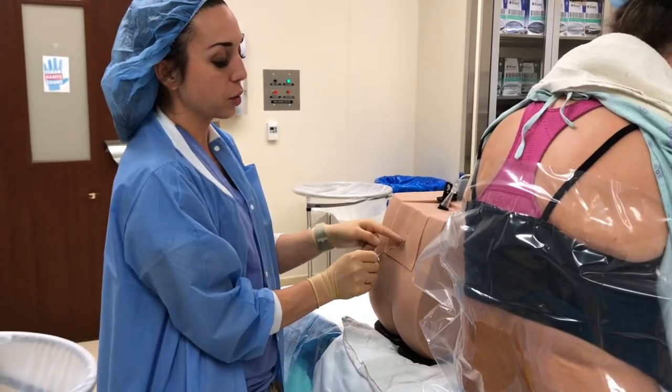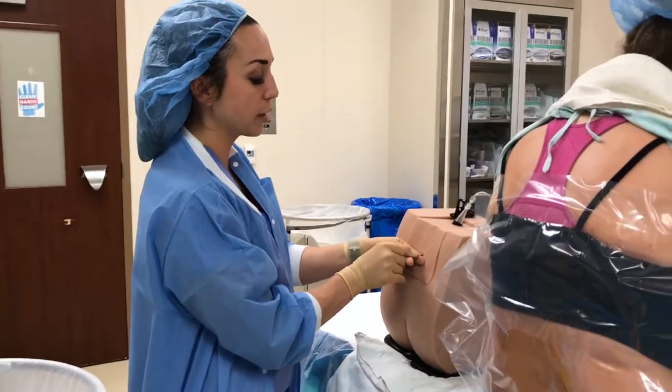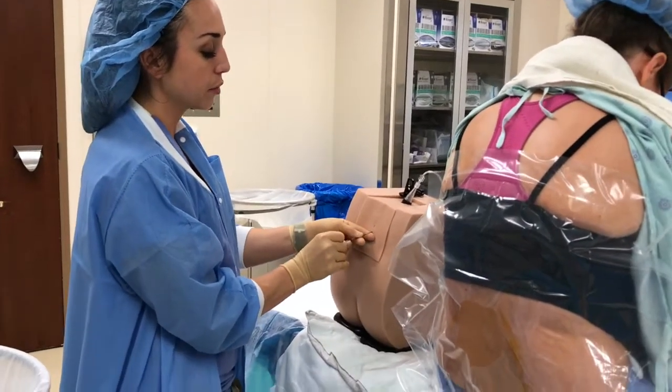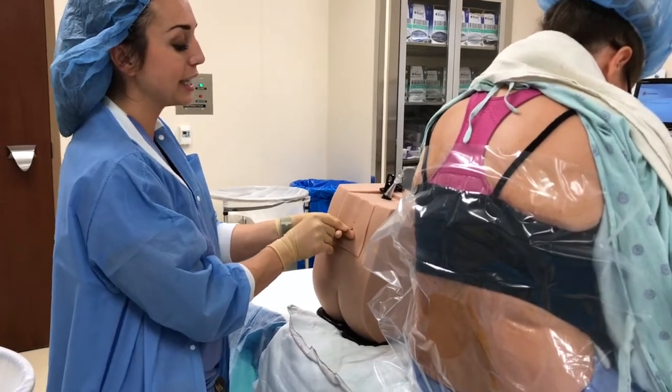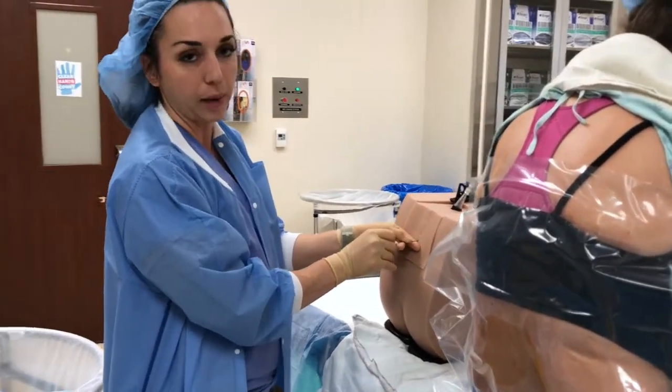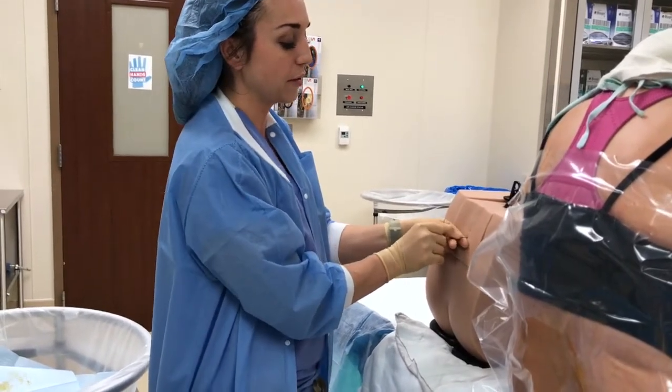Now, as I mentioned, each one of these is a centimeter. For most parturients, you can insert probably a good 2 or 3 centimeters into the tissue, and you should be nice and seated. The goal is to be seated into the interspinous ligament. So that's going to be that kind of gristly ligament that you'll feel, it's kind of tough.